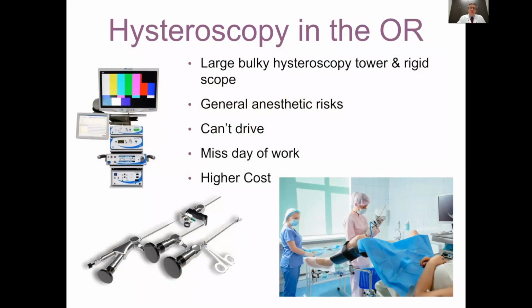Now, hysteroscopy can be done in the office or in the operating room. Operating room hysteroscopy has a few drawbacks. One is that it takes a long time. You have to get the surgery set up, you have to get into that OR, and you have to spend that day investing yourself in that procedure.